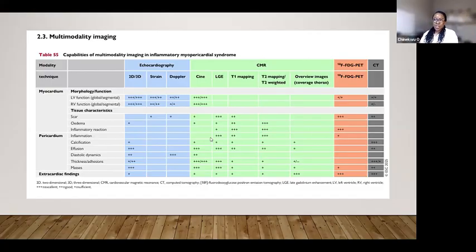But MRI can categorically tell you that, because we can see pericardial inflammation, we can see effusion, we can even test the characteristics of the fluid if there's substantial amounts to put a region of interest over, because we can then tell if it's plain fluid or likely exudate with fibrin and all that, because the T1 characteristics will all be very different.